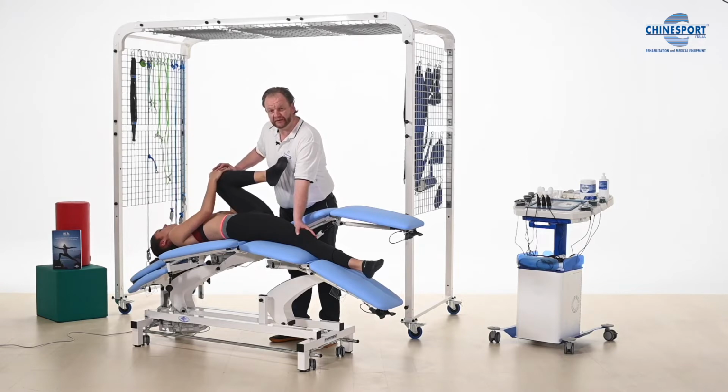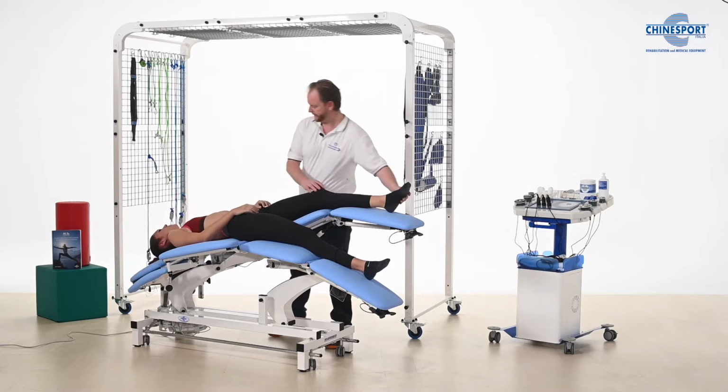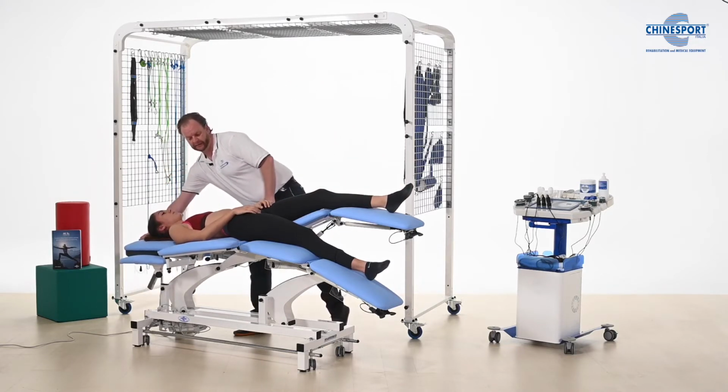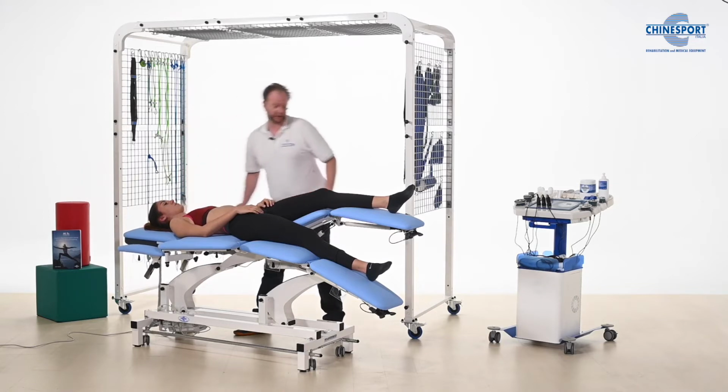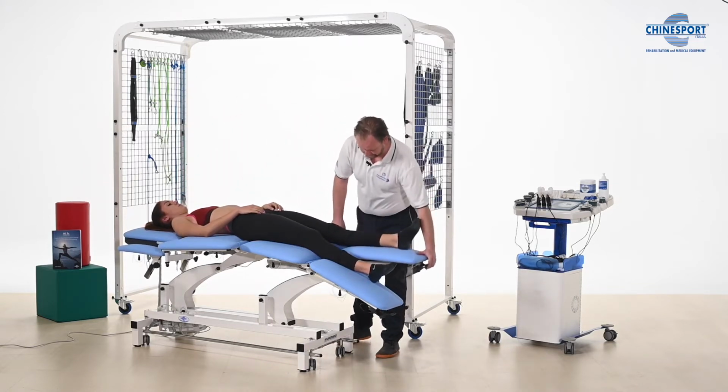And we're using gravity. It's all very gentle, very relaxing for the patient. This is also great for sports regeneration. After some intense training, our patients or our clients then can relax a little bit more.